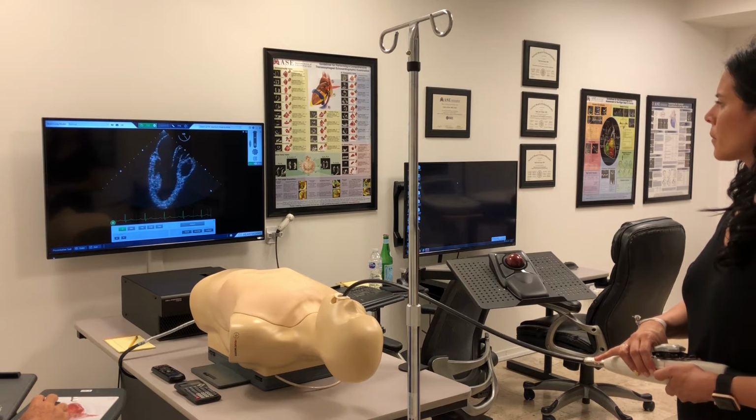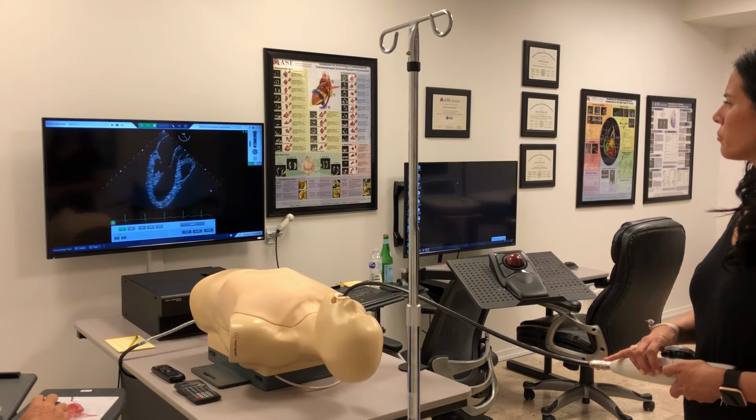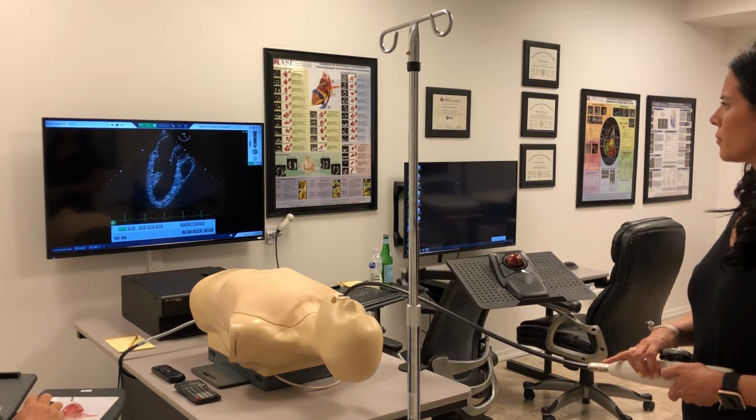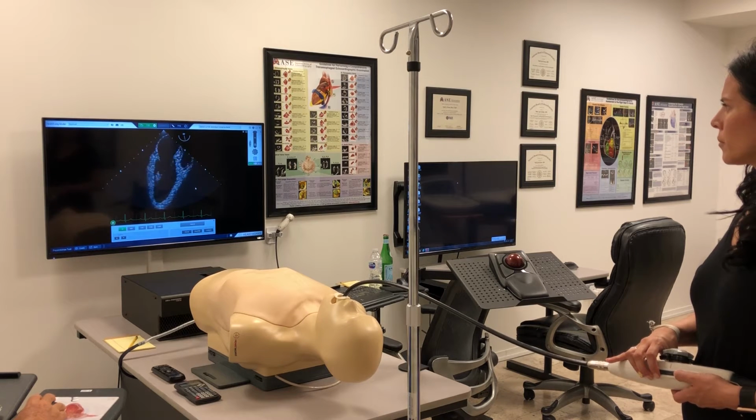Go back to the apex with your eyes. Make sure that it's non-foreshortened with rotation of the probe. And then glance up at the aortic valve again. If it looks symmetrical and full, then you're done with the view. Perfect. So this is a nice long-axis mid-esophageal view. You're looking at the anterior leaflet, specifically A2, and you're looking at the posterior leaflet, specifically P2. Good. Let's go to the next view, which is the five-chamber view. So let's return to the home view.